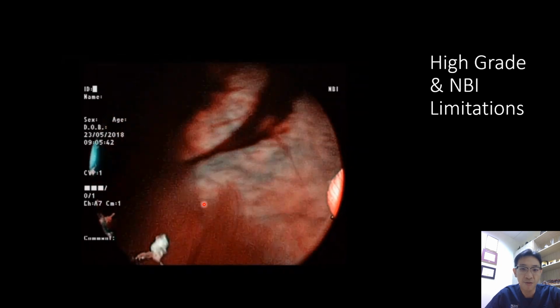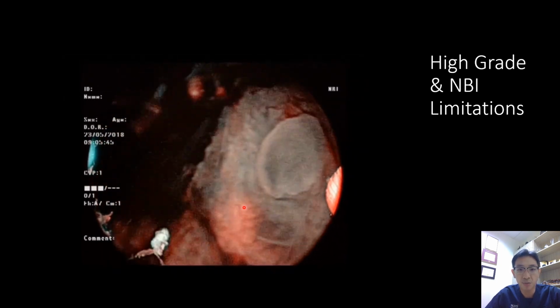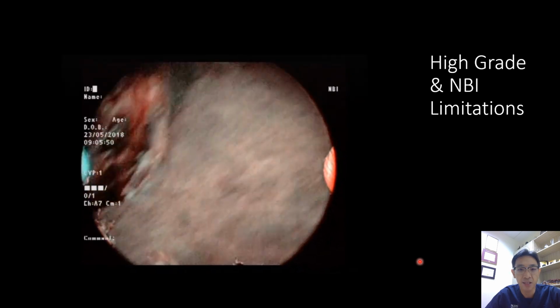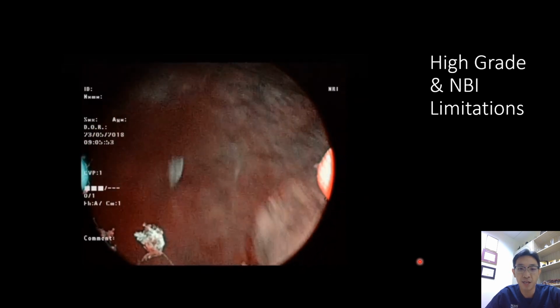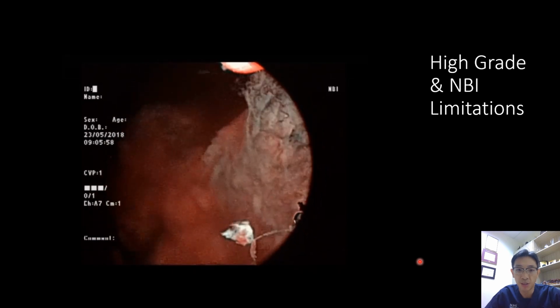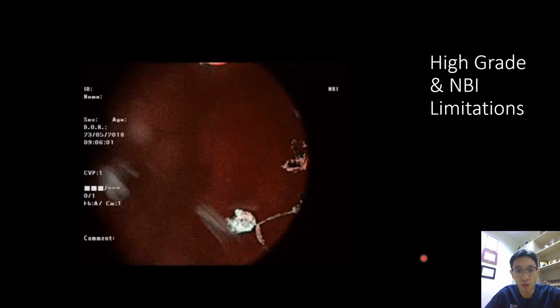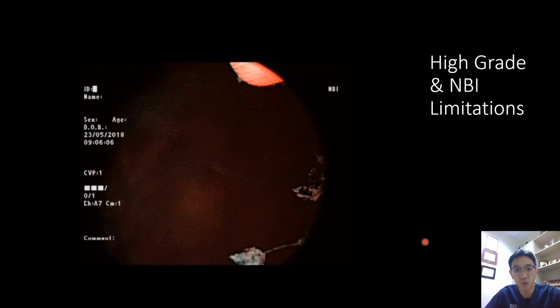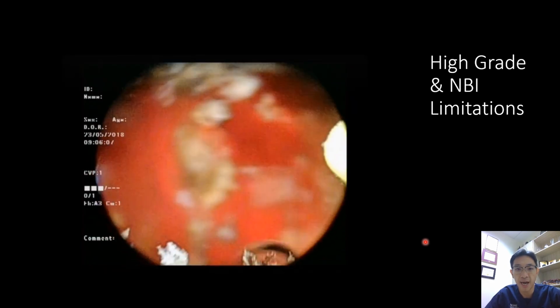And here you find that with the blood clot, multiple nodules, the NBI and any other enhanced imaging will provide very limited other information beyond telling you that these are all tumors. But probably in patients with ongoing gross hematuria, enhanced imaging, NBI, or blue light cystoscopy may not provide additional information.